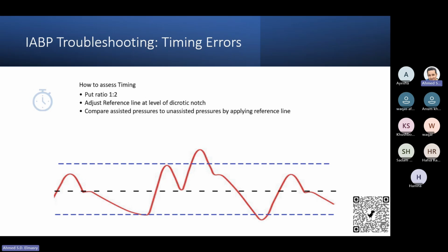The chest compression might displace blood from the heart to the aorta while the intra-aortic balloon is inflated. So it will work in the opposite direction and will not help the patient. So I think the internal mode should not be used in the CPR, but only in the bypass.